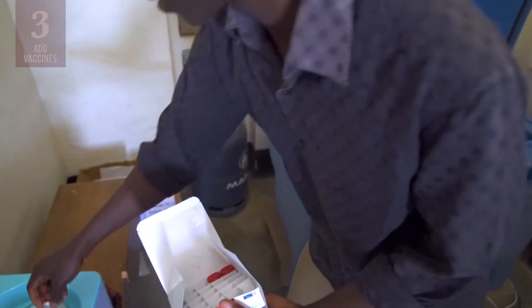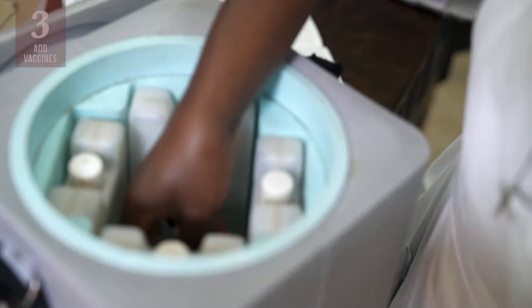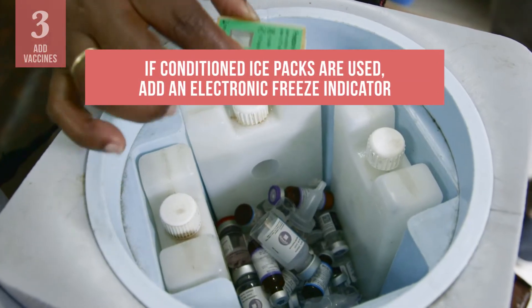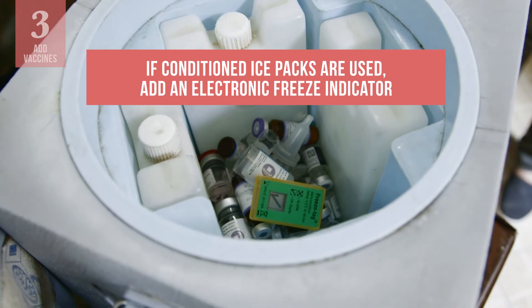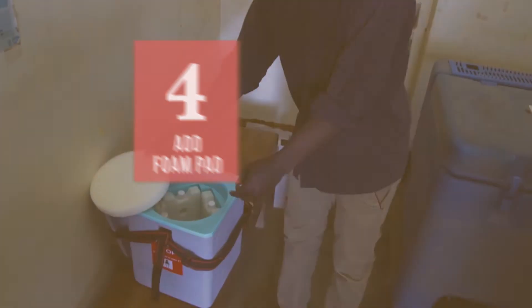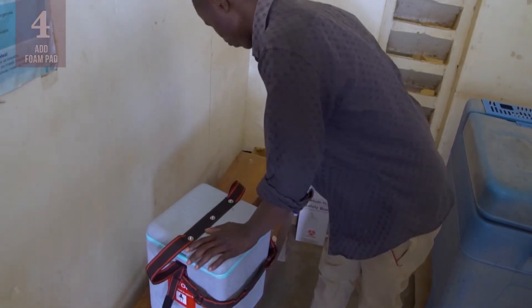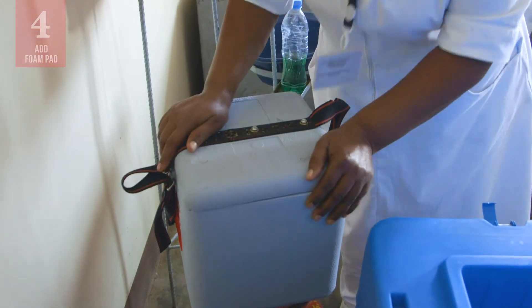Now put the vaccines and diluents in the middle of the vaccine carrier. If needed, put them in a plastic bag to protect them from damage if there is condensation. If conditioned ice packs are used, put an electronic freeze indicator with the vaccines. Next, place the foam pad in the top of the vaccine carrier. Be sure to use the foam pad supplied with the vaccine carrier to make sure it fits correctly inside and allows the lid to close.